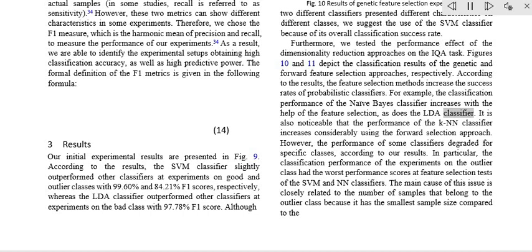Most of the current studies measure the retinal image quality with the help of vessel densities or intensity variations. Additionally, some studies discard non-retinal image identification and are concerned only with retinal image quality. However, non-retinal images can have a negative impact on automatic retinal analysis systems and increase the rate of false positives. For instance, Fleming et al. and Paulus et al. discarded outlier images and categorized retinal image quality. Paulus et al. used Haralick et al. texture features and reported 92.7% of an area under curve, AUC, rate.